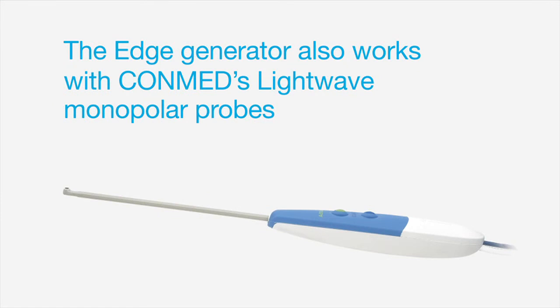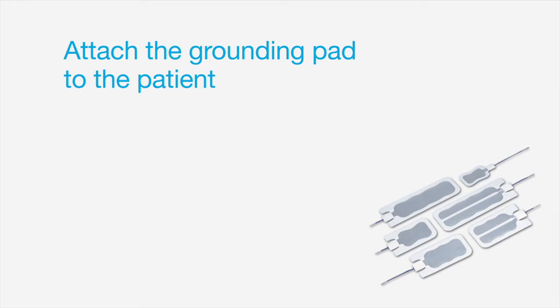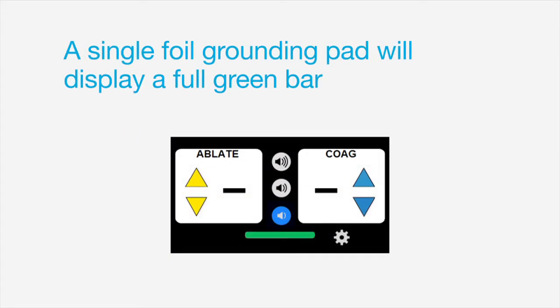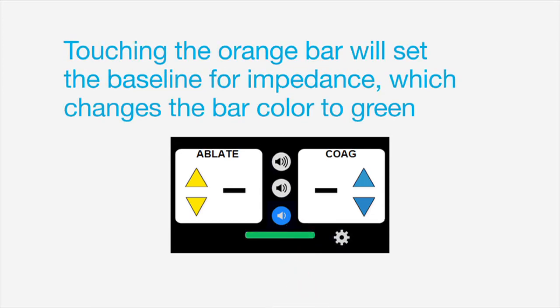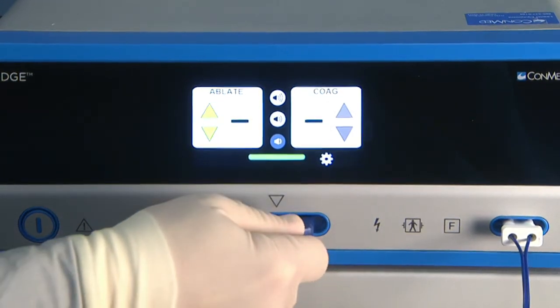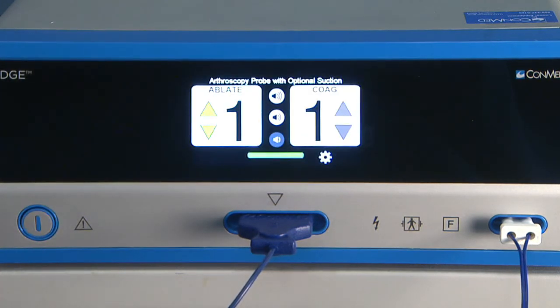The Edge generator also works with ConMed's light wave monopolar probes. To install a monopolar probe, insert the grounding pad connector, then attach the grounding pad to the patient. Edge automatically monitors the impedance level of the grounding pad. A single-foil grounding pad will display a full green bar, while a split-foil grounding pad will display a variable orange bar that fluctuates based on the impedance level. Touching the orange bar will set the baseline for impedance, which changes the bar color to green. If the impedance exceeds the set baseline, the grounding pad arrow alarm will sound. To complete monopolar probe installation, select the type of probe installed from the touch screen, and the probe type will appear on the home screen to indicate a successful connection.